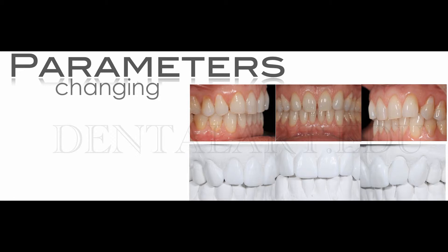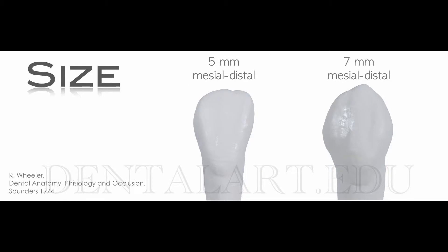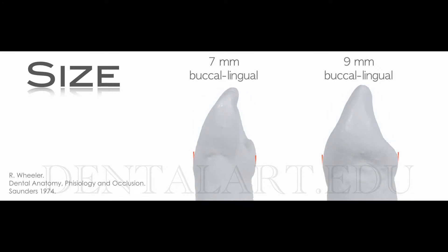For sure, we need an aggressive preparation on the two canines. In natural dentition, a lateral is 5mm mesial-distal and a canine is 7mm mesial-distal. We also took into consideration the buccal size and volume: 7mm for the lateral and 9mm for the canine. However, this is not the most critical factor for the final prosthetic result with veneers.